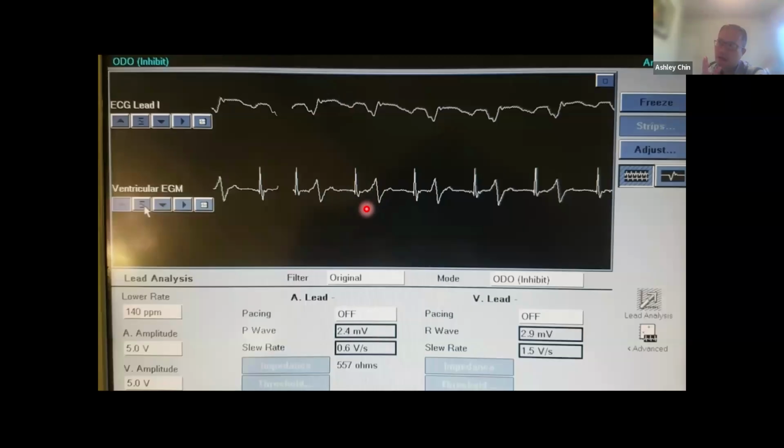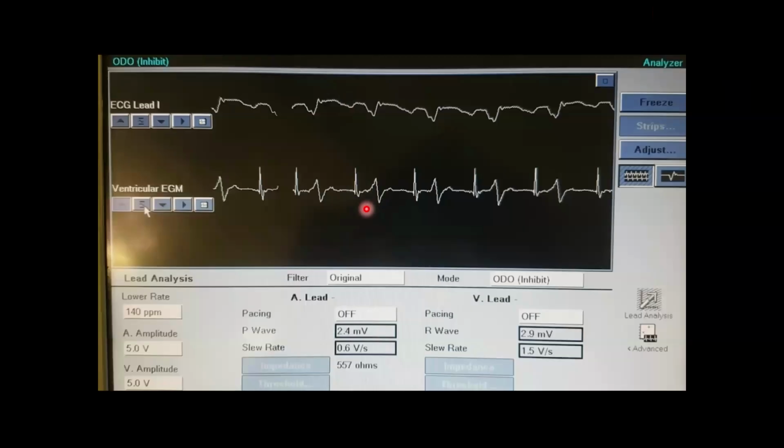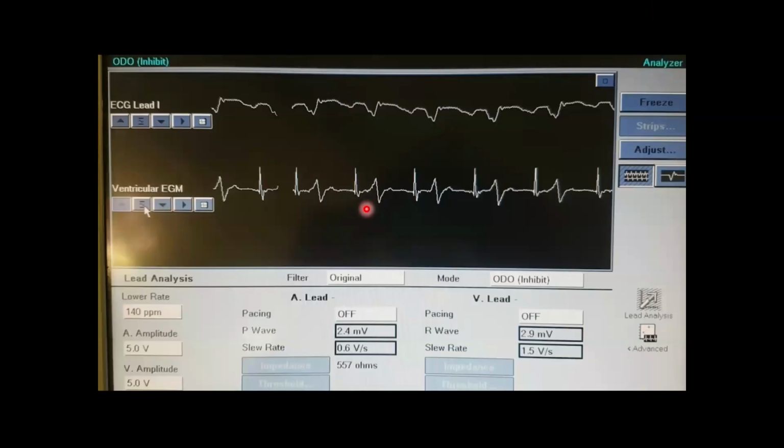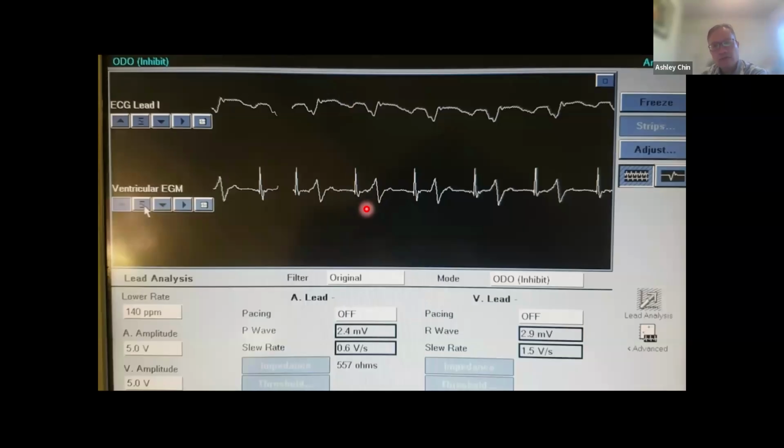I'm at the atrioventricular groove. That's normally where the coronary sinus is located. If I'm in the ventricle, I'm not going to find it there. And if the atrium is too big with no V's, then I'm too much in the atrium. So you can use the signals that you have to help you get into the coronary sinus.